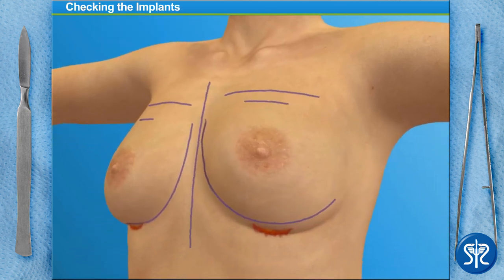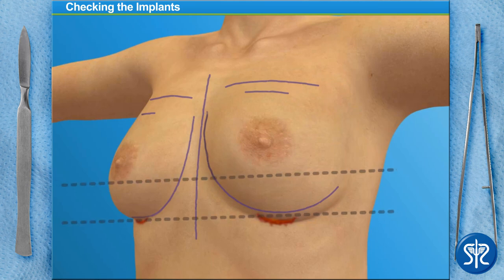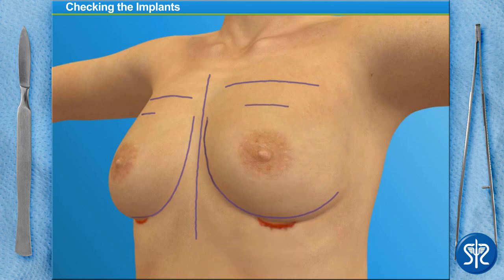Our patient is still under anesthesia, but we've placed her in an upright seated position so we can inspect the breast for implant placement and evenness. We examine the top and bottom of the implants in the breast as well as the placement of the nipples. It looks like the left implant is a little higher than the right — can you lower it? Perfect!